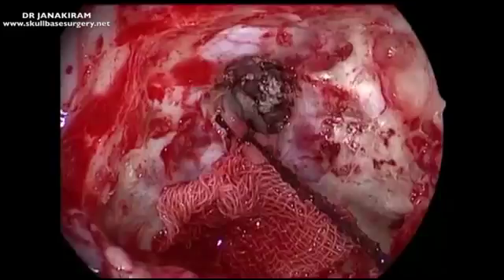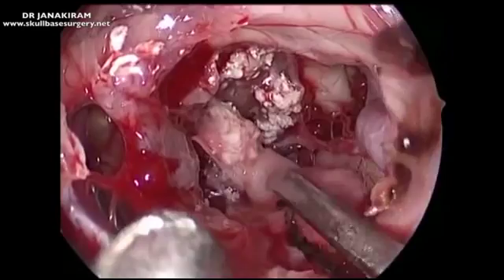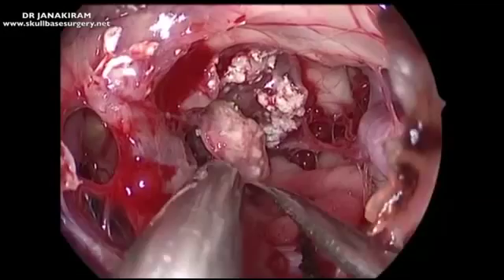You can beautifully see the carotid and the anterior cerebrals being given off. That is the SCA-PCA on the right side — just had a glimpse of that.